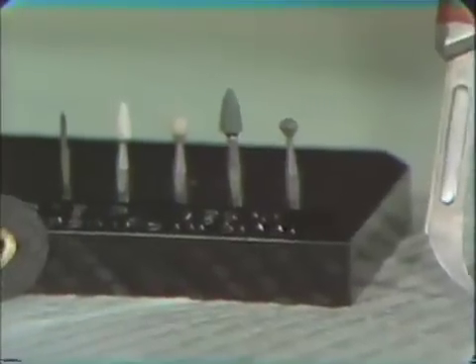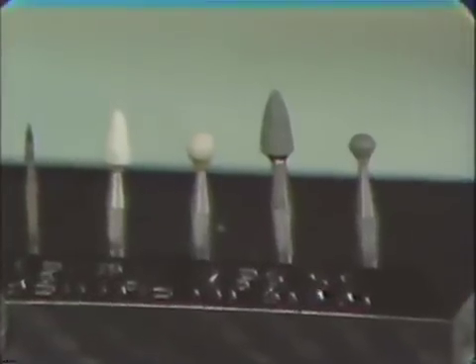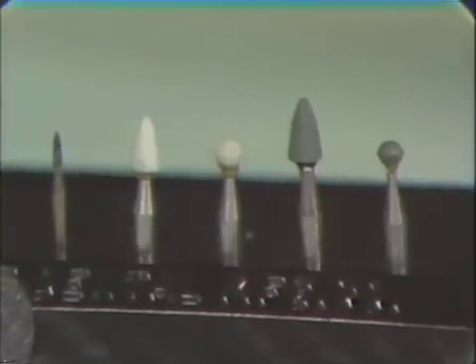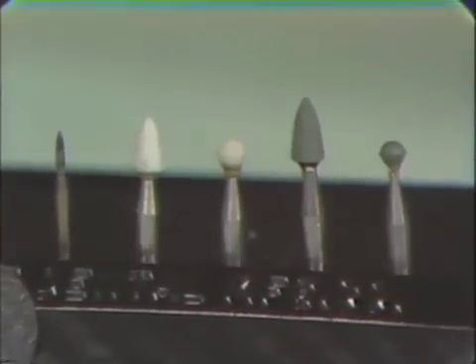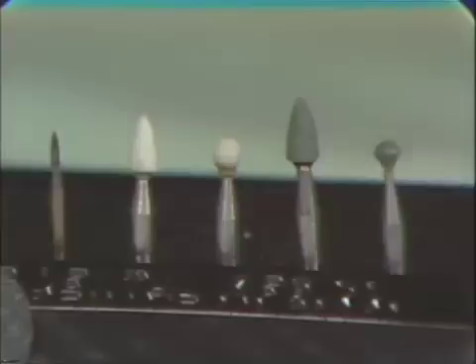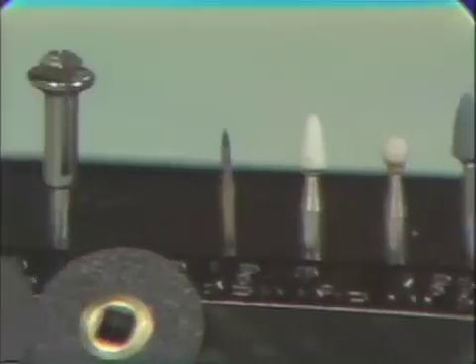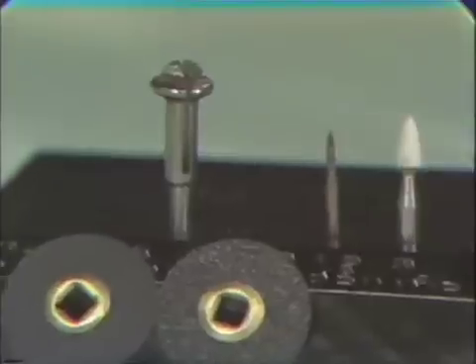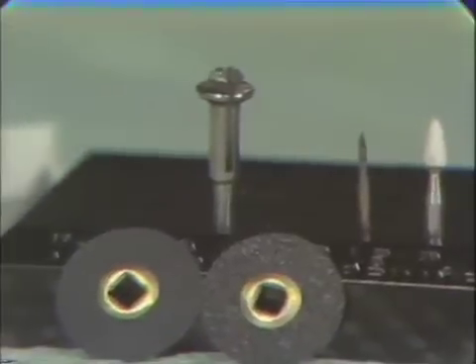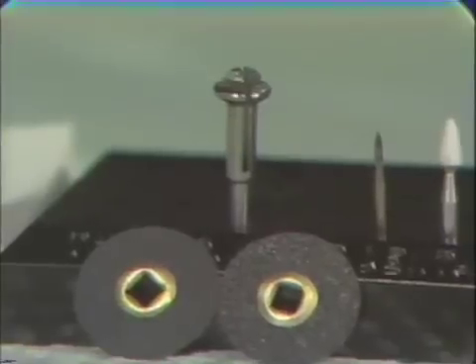Now as we pass across these stones, there's the green stone, round and carrot shaped, the white Arkansas point, round and carrot shaped, and the 7901 burr, a Midwest jet burr for finishing. If you use a green stone, you have to follow that area with a white Arkansas point and the 7901.